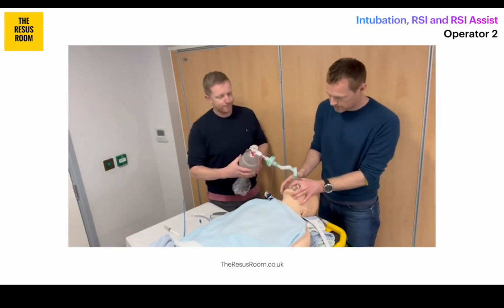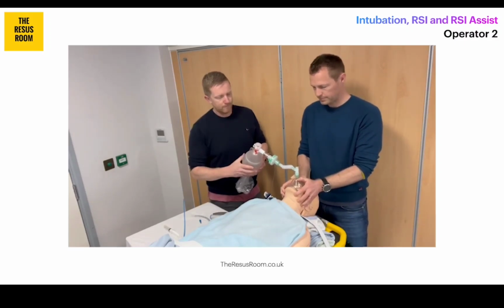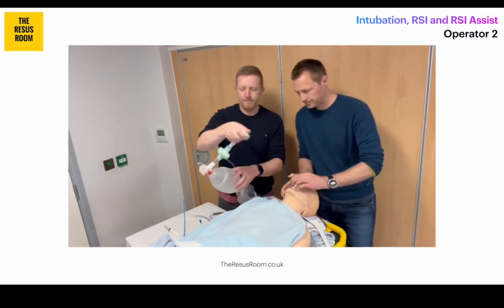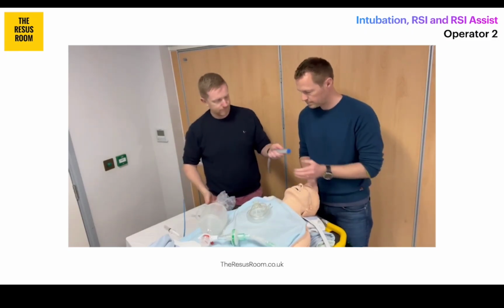So, currently we are pre-oxygenating the patient. We've got a 2-person mask technique with Simon ventilating via the resuscitation bag. So Simon has now disconnected the bag, which remains attached to the end-tidal CO2, the HME and the catheter mount, and he takes that as a whole and lies it on the patient's chest. That's important because that means we've got rapid access to it after the, hopefully, successful intubation.